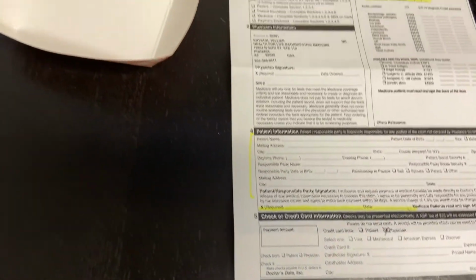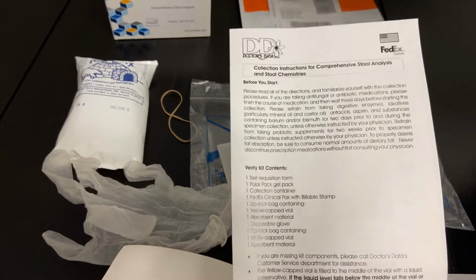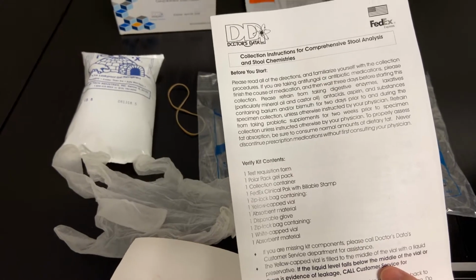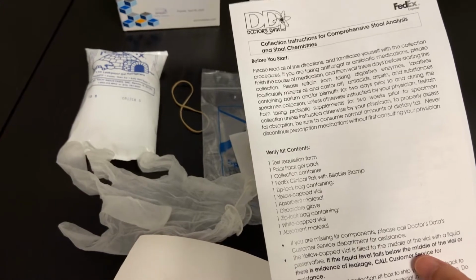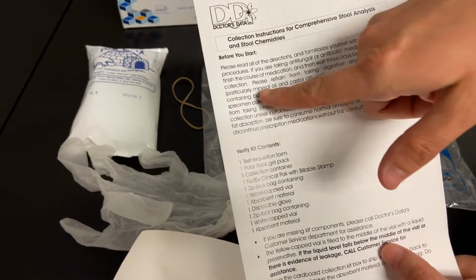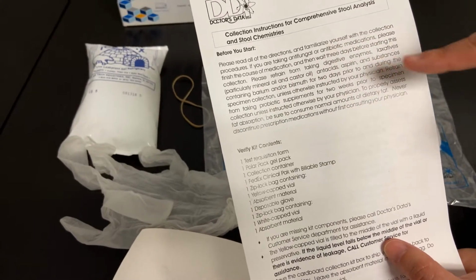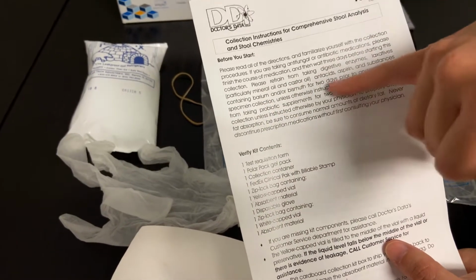I'll draw your attention next to some of the components here. There is a really great outline for how to prepare for this test kit. Importantly, avoid any probiotics for 2 weeks prior. If you're on any antibiotics or antifungals, make sure you have completed those first and then wait at least 3 days before collecting this sample. There are some other things to avoid as well, like digestive enzymes, laxatives, particularly anything that has castor oil or mineral oil in it, antacids, aspirin, or other things with barium or bismuth, for example, for at least 2 days prior to collection.